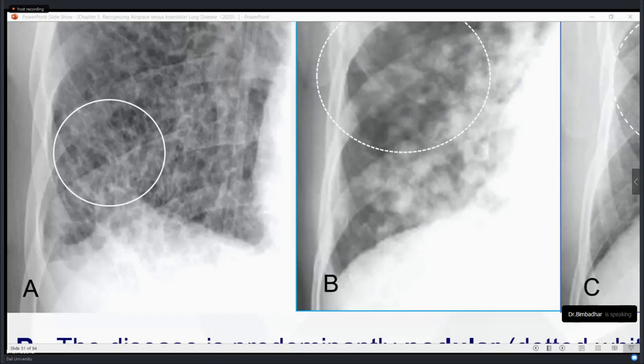See, the way Aman was asking, how do we differentiate between the pulmonary markings and the reticular pattern? The first thing we do with pulmonary markings is that, as a basic anatomical fact, every bronchus is accompanied by its corresponding pulmonary blood vessel, right?